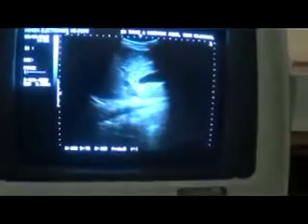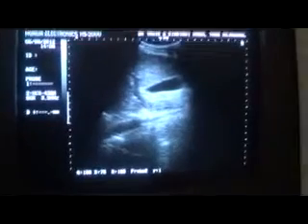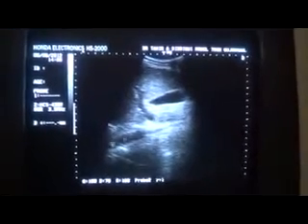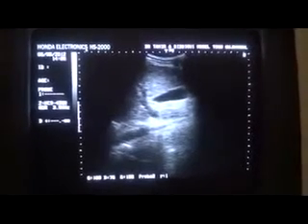You may have to go upwards a little bit in some patients, and then with the same maneuver you will be able to get the view that is in front of you that I am getting from this position that I have showed you initially. Now this view, you see that this is the gallbladder and this is the common bile duct. This is the inferior vena cava. This is the liver. So the portal vein runs at 90 degrees over to the neck of the gallbladder.